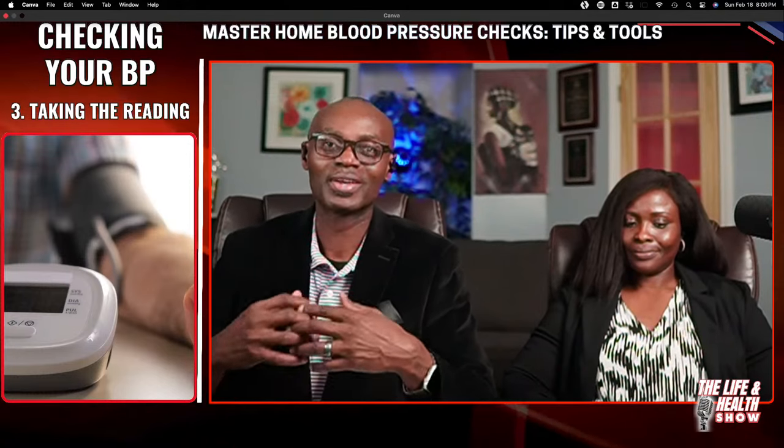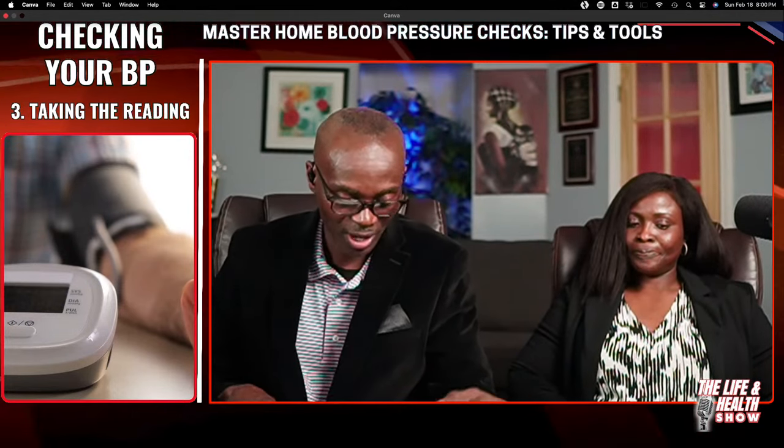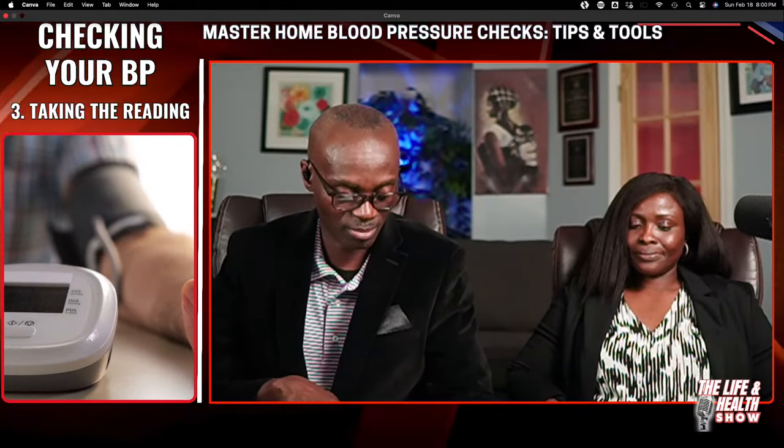That number is bad because as you scream, as you shout, your heart may just do something else. So you don't want that. You got to be fully calm, relaxed, and quiet. Even if the kids are breaking down the house, you remain quiet, unless you take it all over again. You can't just pause and do your own thing and then read. No, that's bad. You definitely have to be quiet and calm as you read your numbers to get the right numbers.